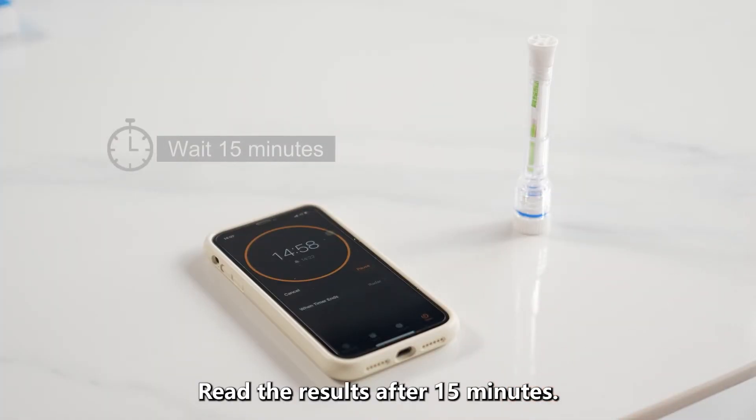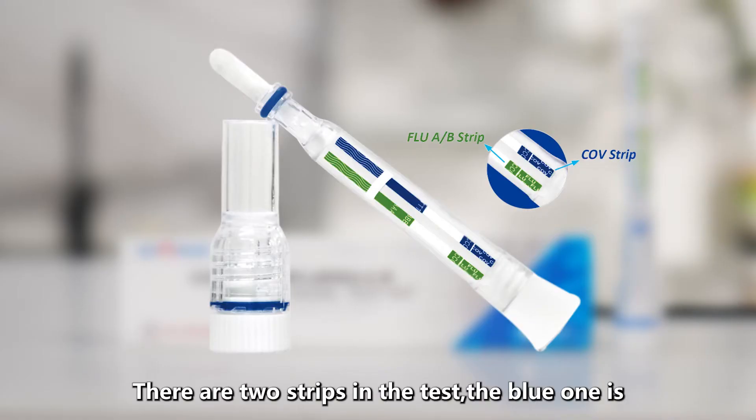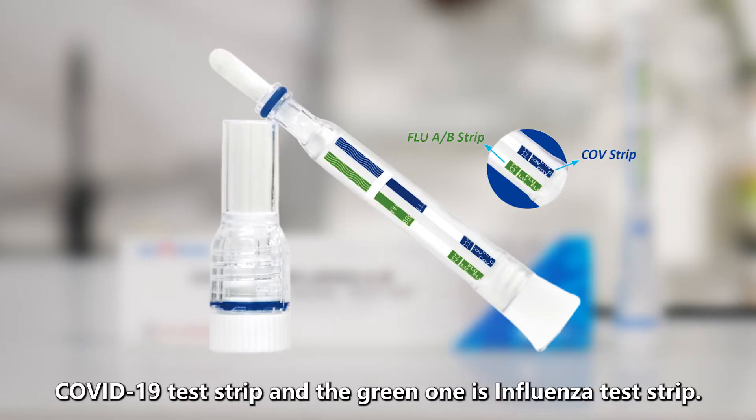Read the results after 15 minutes. Do not read the results after 30 minutes. There are two strips in the test: the blue one is the COVID-19 test strip, and the green one is the influenza test strip.